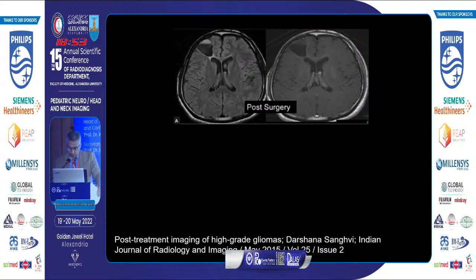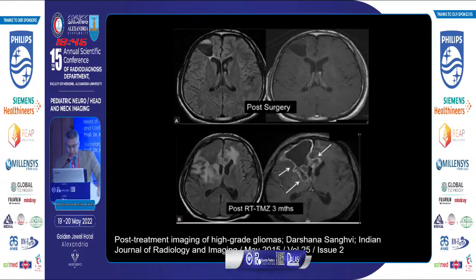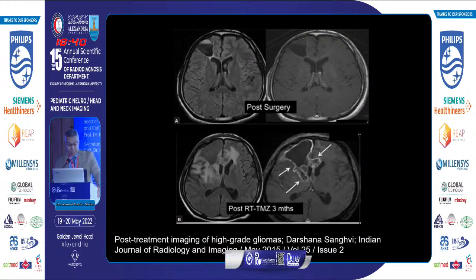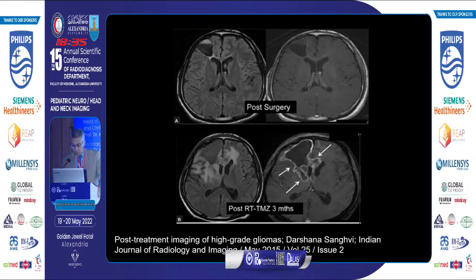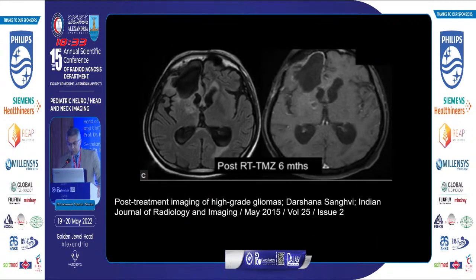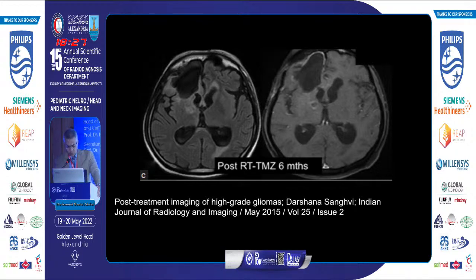This patient was resected for right frontal lobe glioblastoma multiforme and received radiation therapy. During follow-up, there is an irregular enhancing lesion at the operative bed associated with moderate mass effect. Is it tumor recurrence or just post-radiation necrosis? The next follow-up revealed marked regression of the enhancing lesion at the operative bed, consistent with post-irradiation necrosis.